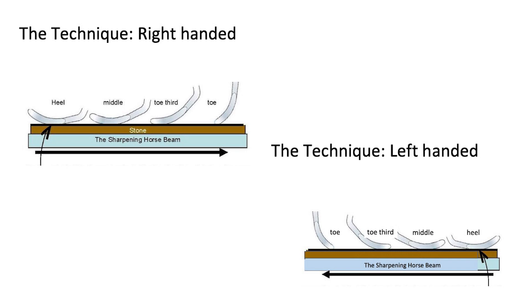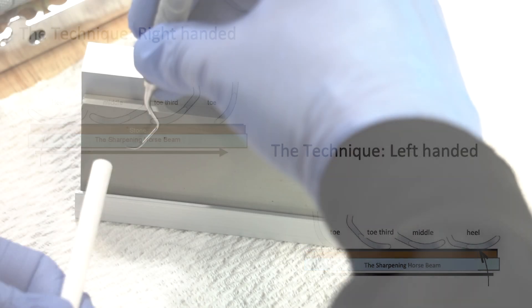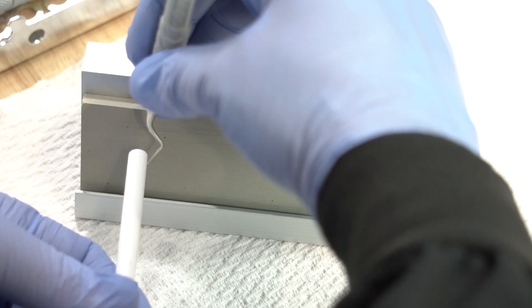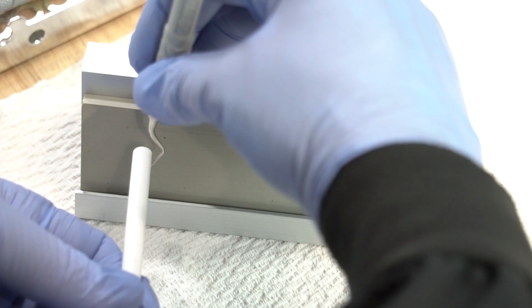The basic technique for sharpening with the sharpening horse is to take any instrument and make sure the face is parallel to the tabletop. You can help yourself with this visualization by using the stick that comes in the kit.